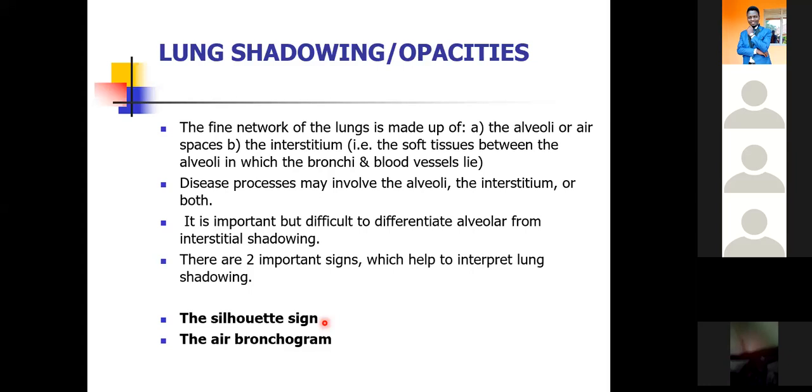Again, when we are presented with images of the lungs, one big conclusion that we can draw is that there are diseases that will result in lung opacities or shadowing. So it will transform the lungs from looking black to looking white.